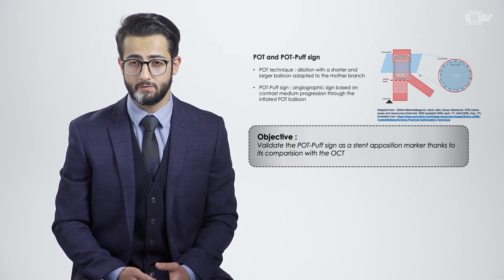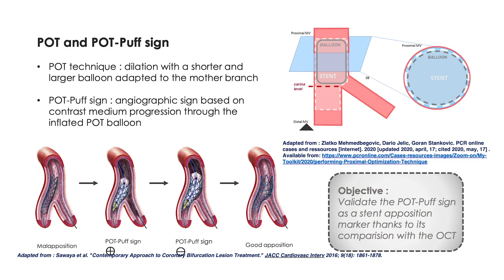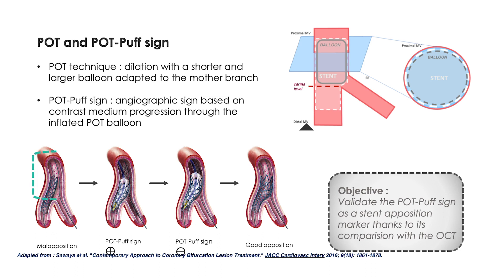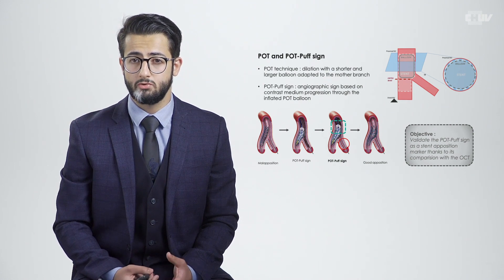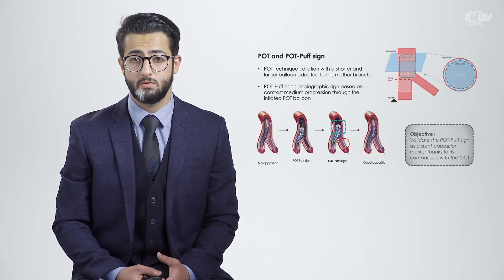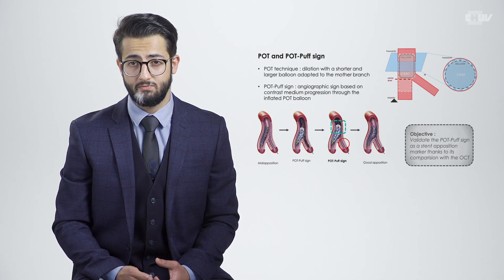So basically, how to perform a POTPOP sign? Let me use this example to illustrate. We are in a bifurcation and this larger part is the mother branch. As you can see, the inflated balloon isn't large enough to be occlusive — that would be a positive POTPOP sign, with the progression of the contrast medium through the inflated balloon. By increasing the diameter of the balloon we assess apposition; the contrast medium can no longer progress through the balloon, and that would be a negative POTPOP sign.